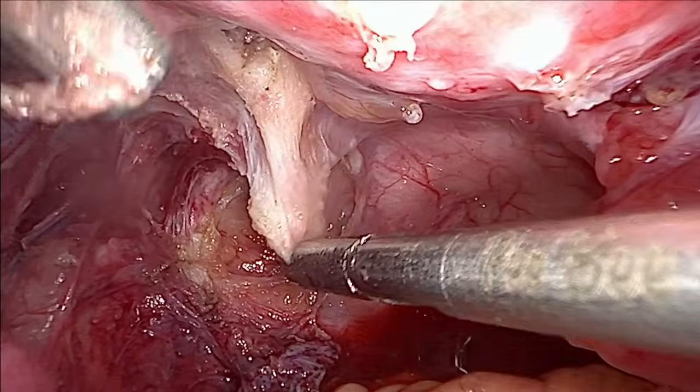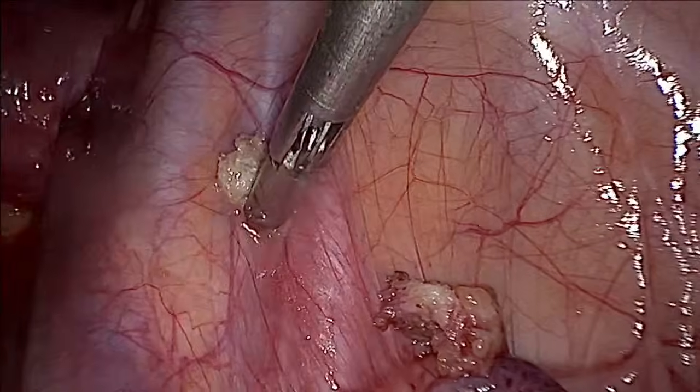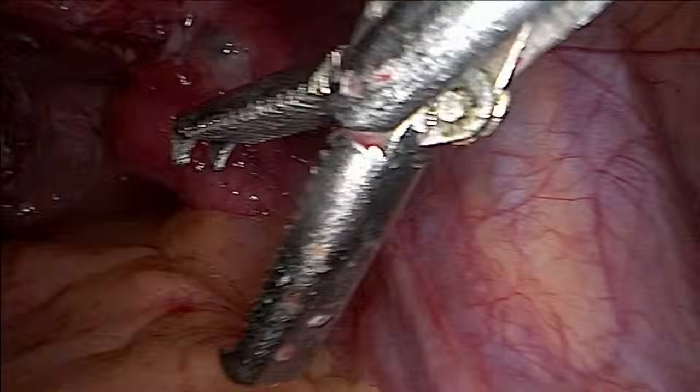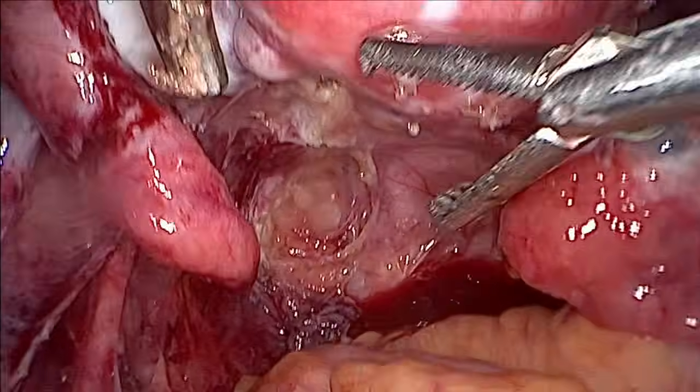Just beware of the rectum there. You can safely park it here for now. There's a small fibroid actually there. Rasik, fibroid.